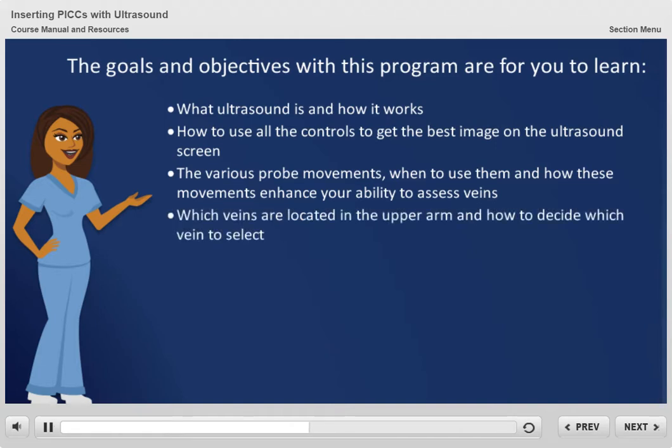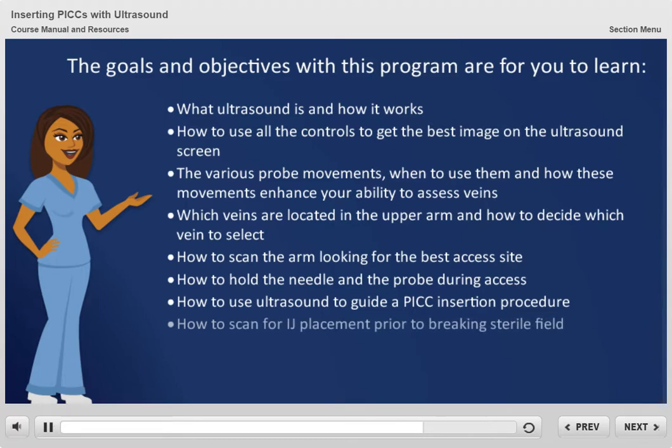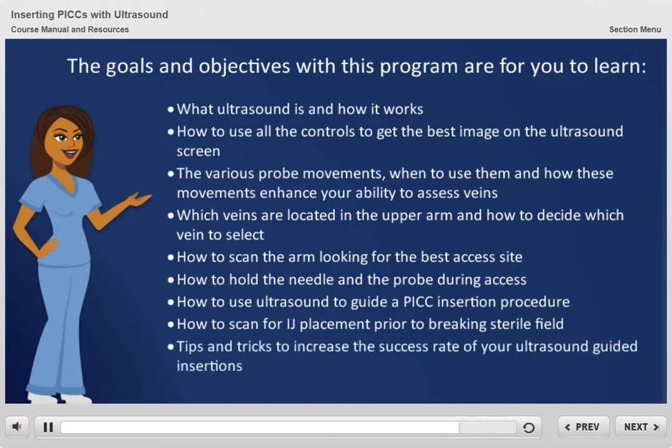Which veins are located in the upper arm and how to decide which vein to select, how to scan the arm looking for the best access site, how to hold the needle and the probe during access, how to use ultrasound to guide a PICC insertion procedure, how to scan for IJ placement prior to breaking sterile field, and tips and tricks to increase the success rate of your ultrasound guided insertions.